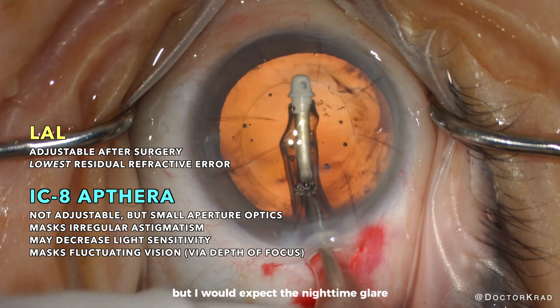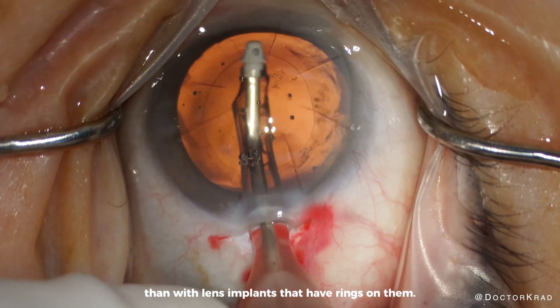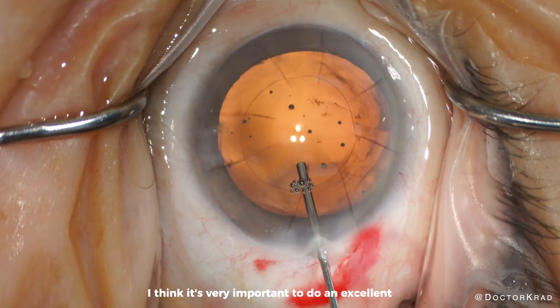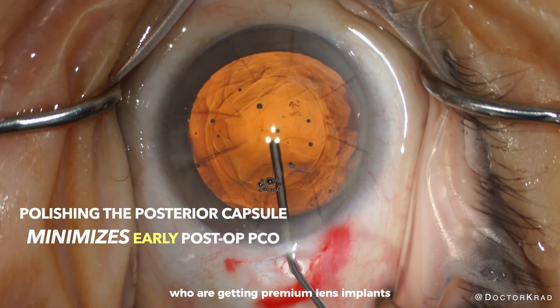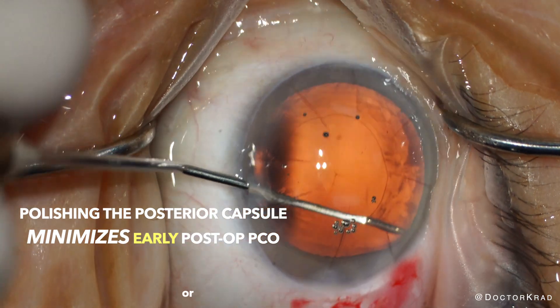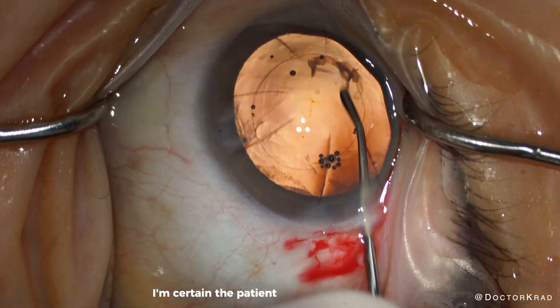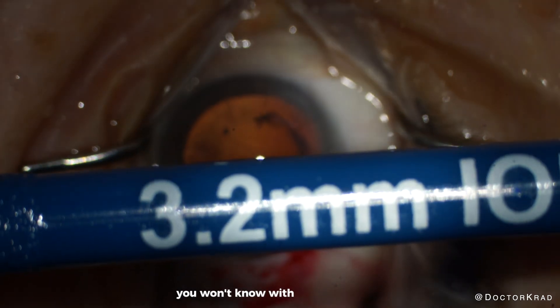I would expect the nighttime glare and halos to be much less with the IC8 Apthera than with lens implants that have rings on them. Now we have finished removing the lens cortex, and I am polishing the lens capsule. I think it's very important to do an excellent job polishing the capsule, especially for patients who are getting premium lens implants, so you don't want to be fooled by an early PCO or posterior capsular opacification in the early post-op period. I don't like performing YAG capsulotomy unless I'm certain the patient likes their lens implant.